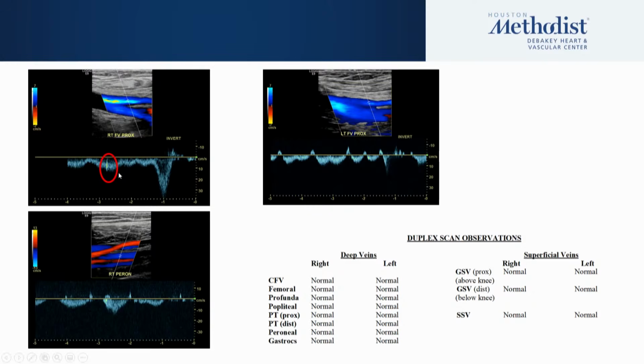And this is quite interesting. I've never seen that before, but it was one of those things I thought I'd share with you guys.